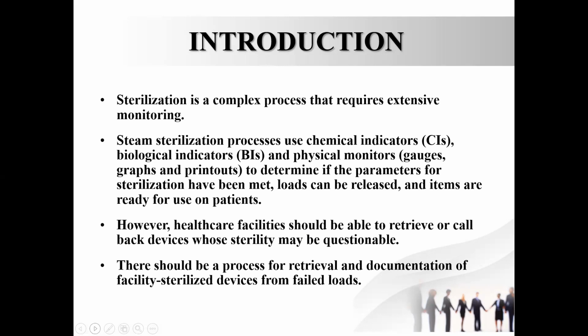But in case something goes wrong, the healthcare facility should be able to retrieve. Retrieve means call back the devices whose sterility may be questionable or which they are doubting. There should be a process for receiving or calling back items, and everything that is received as a callback should be documented, especially if it's a failed load.